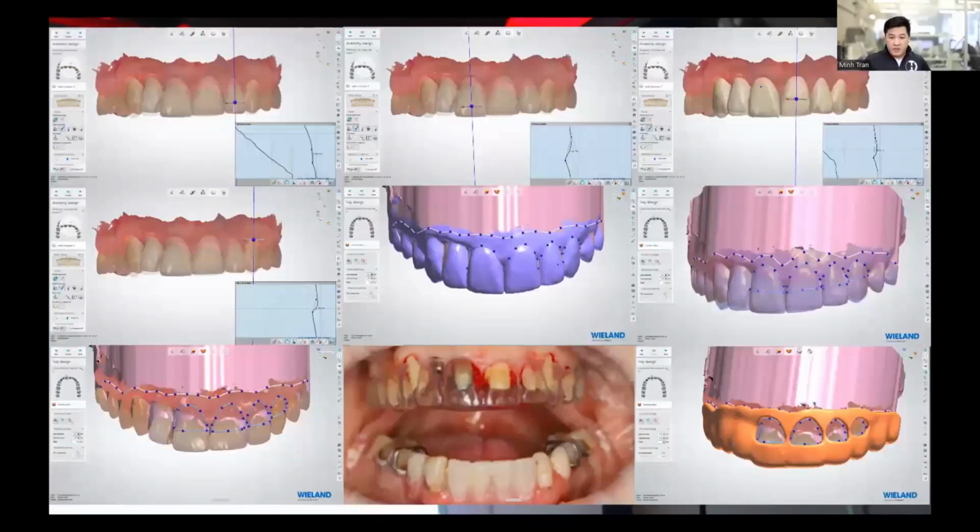So what we did was I took my design, I overlaid those gingival proportions. I sent this CAD design to the general dentist as well as the periodontist. All three of us got on the phone at the same time, or Zoom meeting. I think it might have been a Zoom meeting at that point. And we say, you know what, this is how much I think it's going to look good based on my arbitrary cosmetic assessment of the case. And of course, the periodontist knows better than me. That's not clinically feasible. He says, you know what, you're violating the crown to root ratio too much on these 3 teeth here. Back it up a little bit, and then send me another proposal.